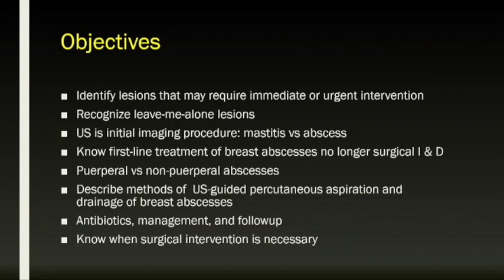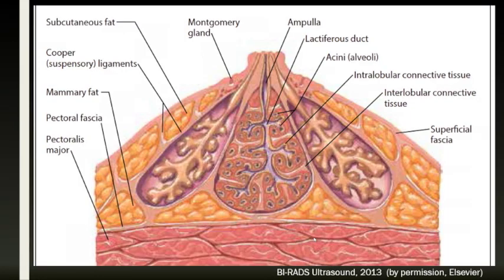So this morning, we're just going to be talking about some lesions that may require immediate or urgent intervention, as well as some that really should be left alone. The management of many of these lesions is the same.